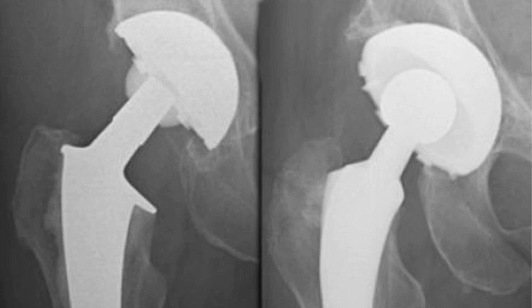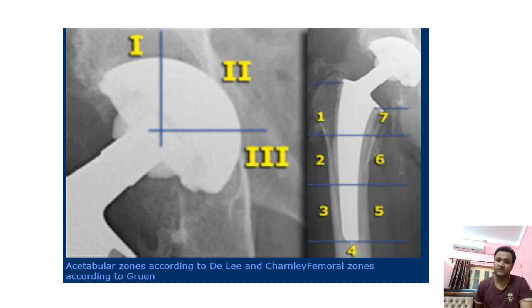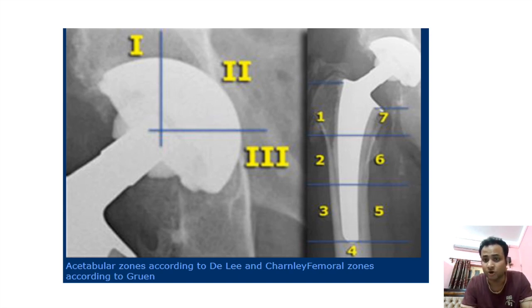This is the imaging depiction of the modular-based prosthesis placed in the right hip joint. We can see the acetabular cup along with the femoral stem and a liner on the inside — one cemented and the other non-cemented. These are the Gruen zones which we must look at when evaluating a limb after placement of a prosthesis.